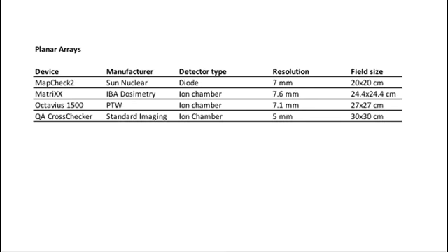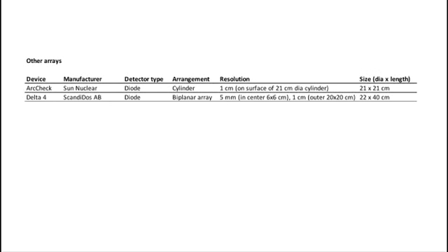So I don't know, hopefully I've listed most of the major ones here. I don't know if I've gotten every single one, but if you see one that you like that's not here, let me know. And then here are these non-planar devices. We already looked at the first one. The second one has an interesting design.